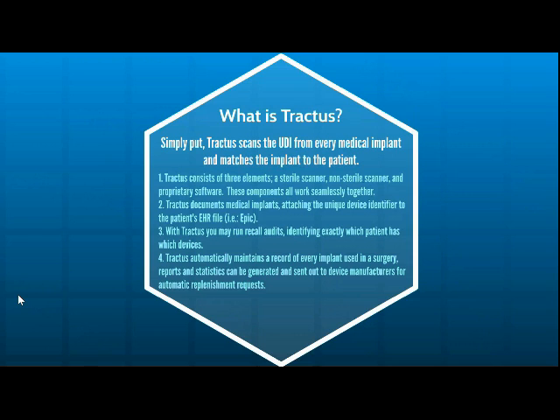Essentially, the Tractus drape will go over the scanner, and then that would be placed either by the re-sterilized sets for spine surgery or trauma or for orthopedic cases, and then that would be sitting in the sterile field in a wireless setting and then transferring that information.